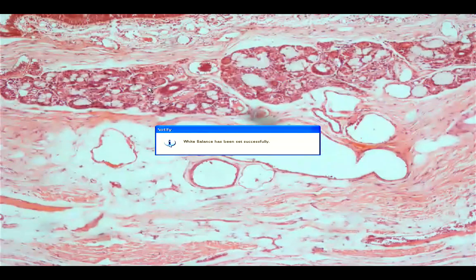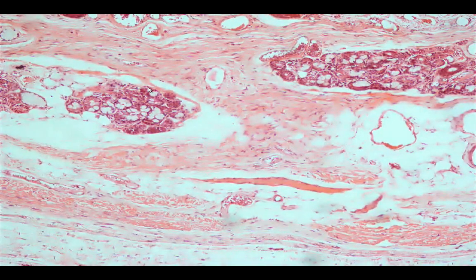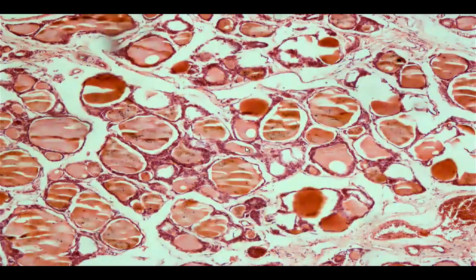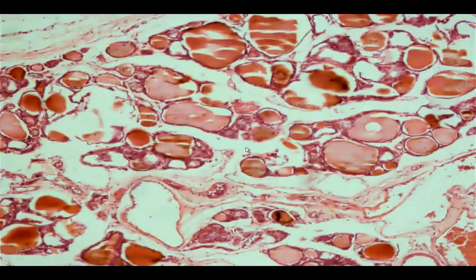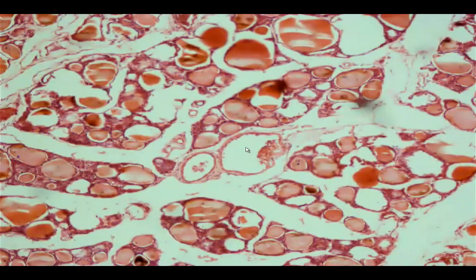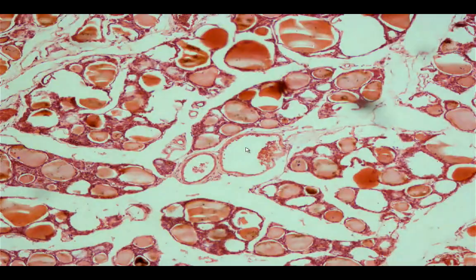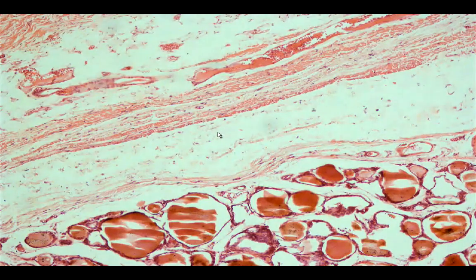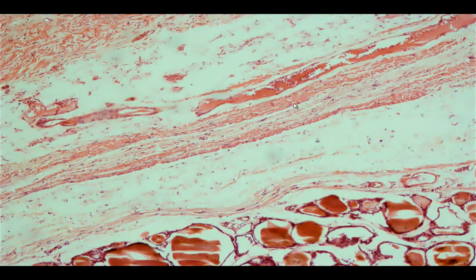At lower magnification, you have the submucosal portion, and the cartilage plate — described in the textbook as a C-shaped cartilage plate consisting of hyaline cartilage. Note that in this particular slide, there is thyroid tissue present, with colloid visible within the lumen of the thyroid follicles. There is also a muscle present in this layer called the trachealis muscle.